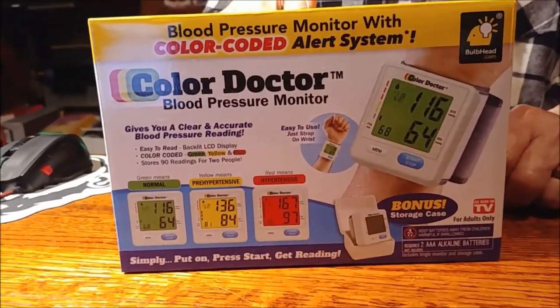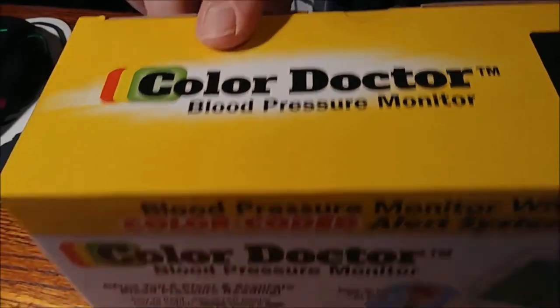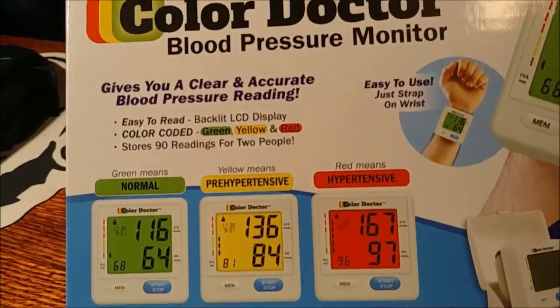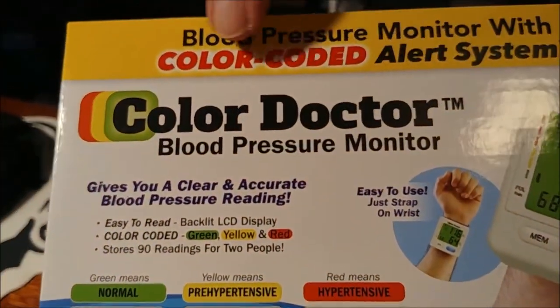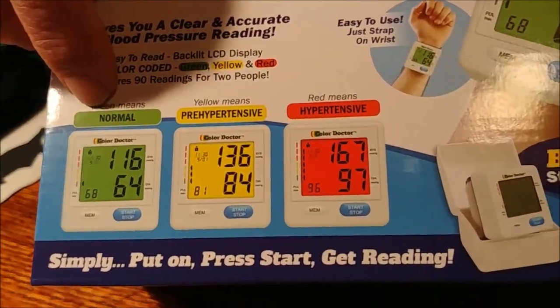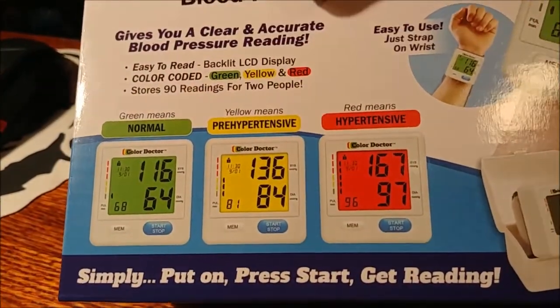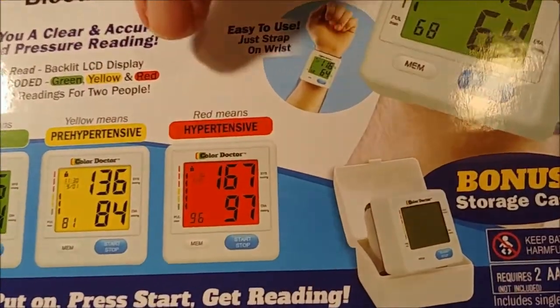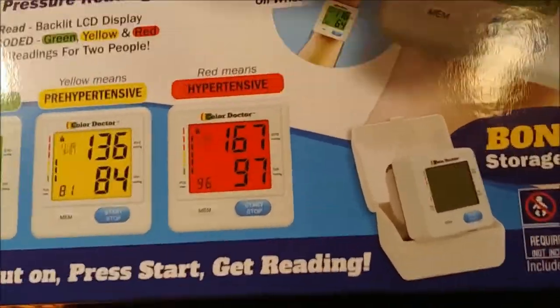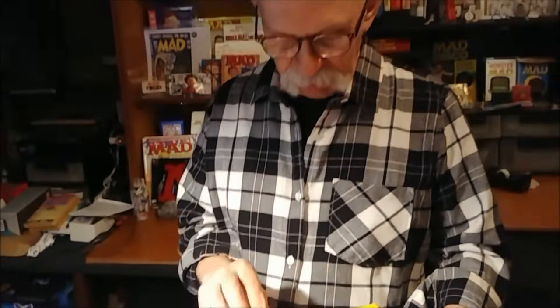Color Doctor blood pressure monitor. And I'm assuming you probably get some crayons in there. So if you color the screen green, you'll be normal. If you color it yellow, you are pre-hypertensive. And if you color it red, then you are hypertensive.